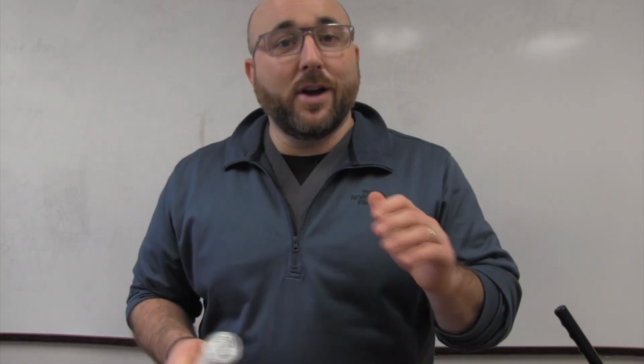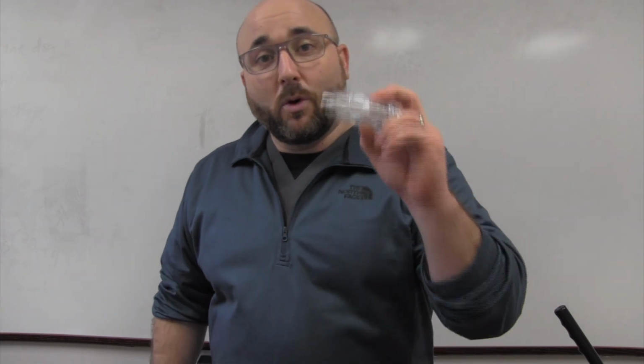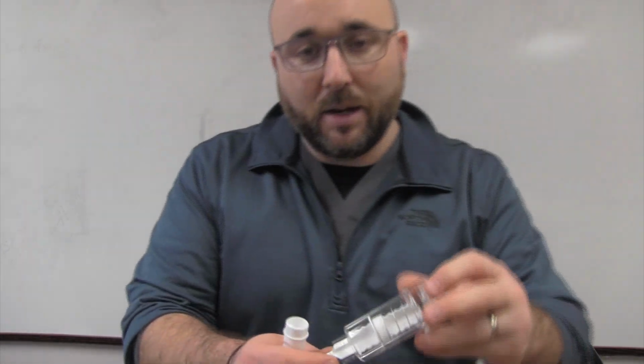Well, whether you know it or not, and you've seen it, if your patients are having trouble breathing, they're using every muscle they have. And these muscles can be weakened over time. So it's really important, especially for somebody who is motivated to do the work, to improve their muscles. Just like going to the gym and doing curls, your respiratory muscles are very important. Your intercostals, sternocleidomastoids, a lot of muscles in your chest that are really important, and you can work them with this device.